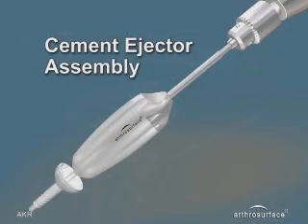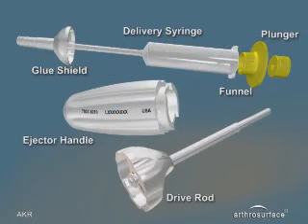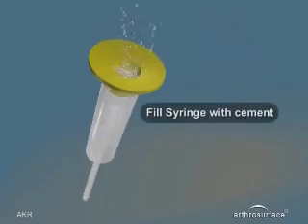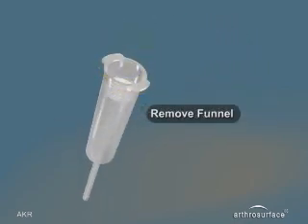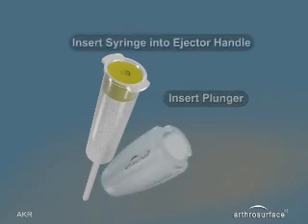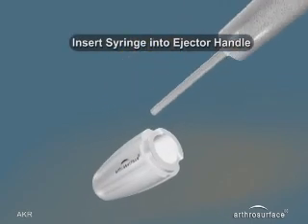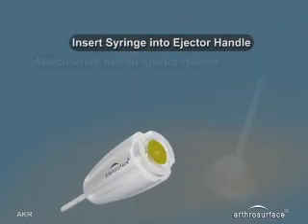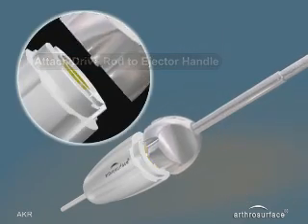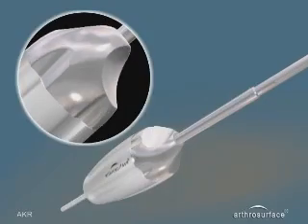Keeping traction on the sutures, we assemble the Arthrosurface cement ejector, which is done by putting low viscosity cement through the funnel and into the syringe. Insert the yellow plunger so that it is flush with the back of the syringe, and insert the syringe assembly into the ejector handle. Attach the drive rod to the handle using the J-lock locking system.